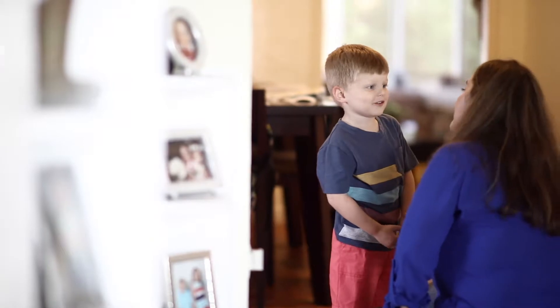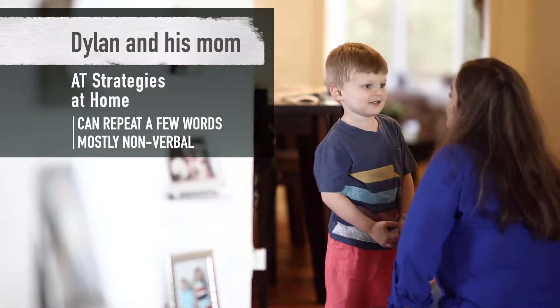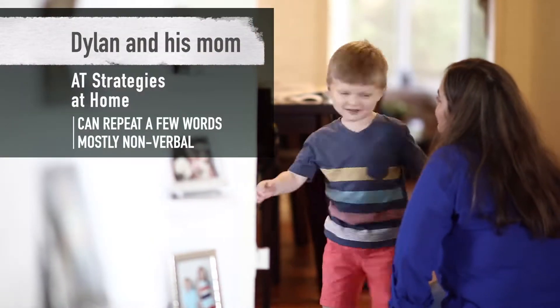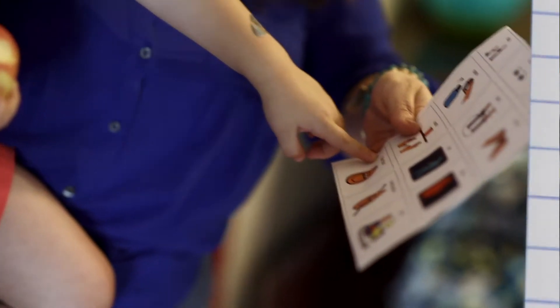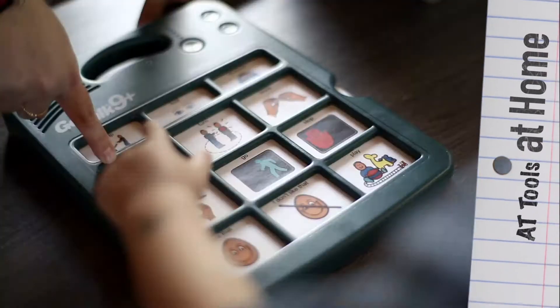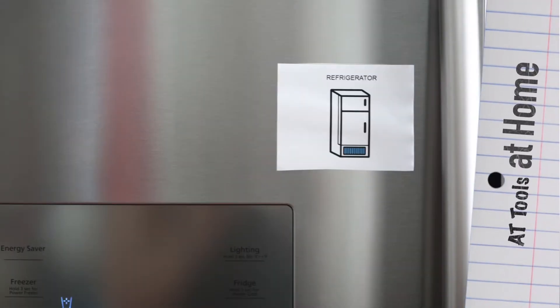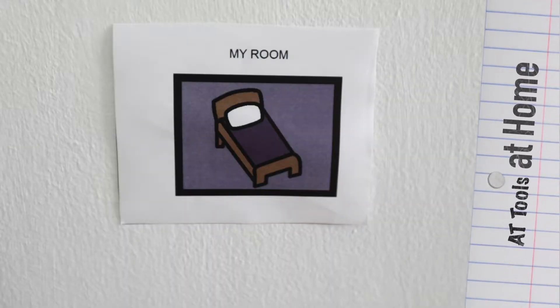Meet Dylan and his mother. Dylan can repeat some words, but he is mostly nonverbal. To help him communicate, Dylan's mom has created several communication tools to use at home.